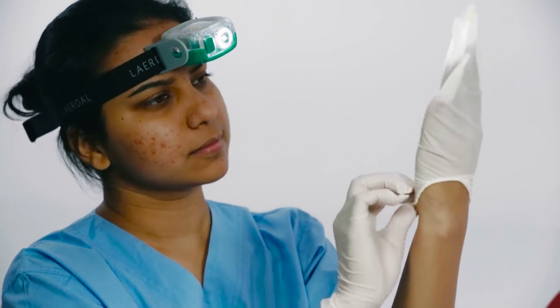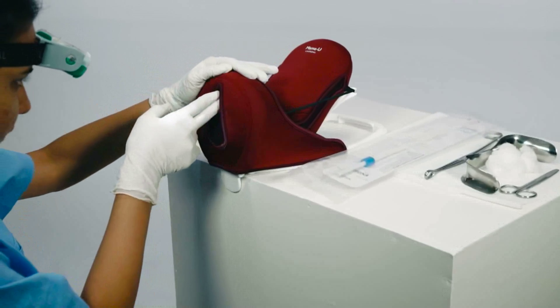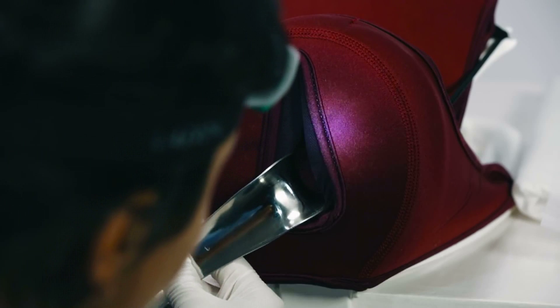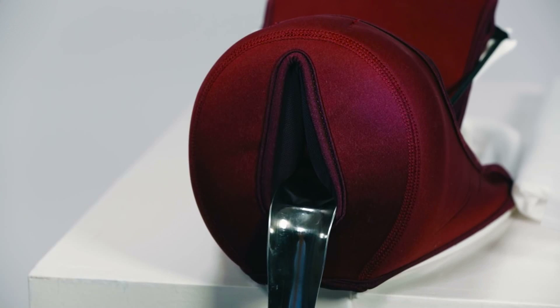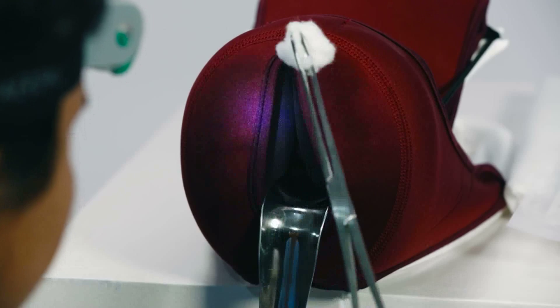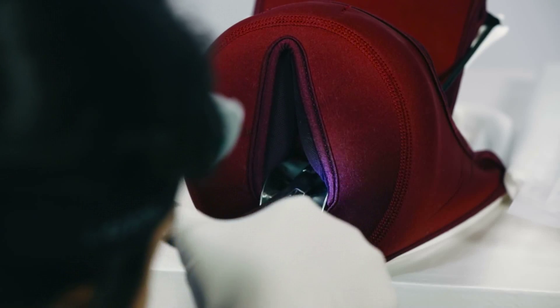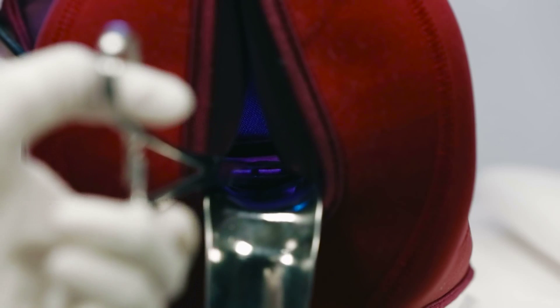If using a headlamp, put on the headlamp and gloves. Inspect the perineum for lacerations. Visualize the cervix by inserting a speculum in the vagina and depressing the posterior wall of the vagina. Gently clean the vagina and the cervix with an antimicrobial solution. Grasp the anterior lip of the cervix with forceps.